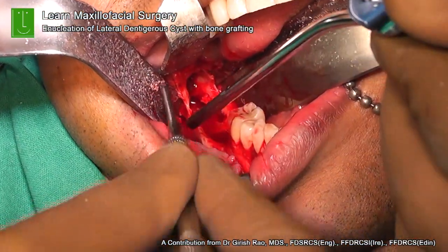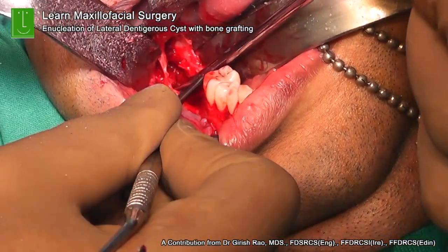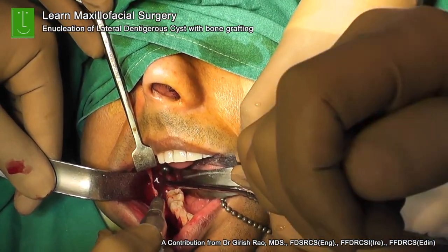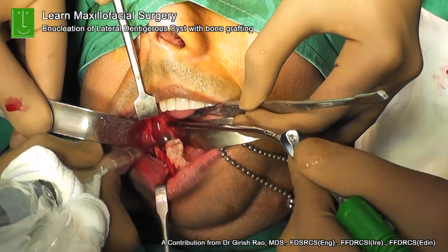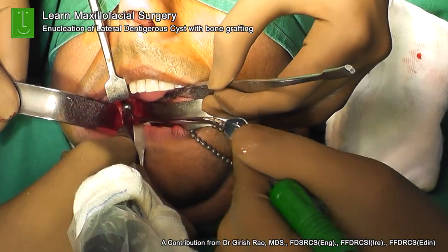And that's where you can see the perforation of the buccal cortical plate. So there is a small sliver of bone at the crestal area which we have preserved, and any sharp edges on both the buccal as well as the lingual cortical plates are trimmed with a large rosette surgical burr.